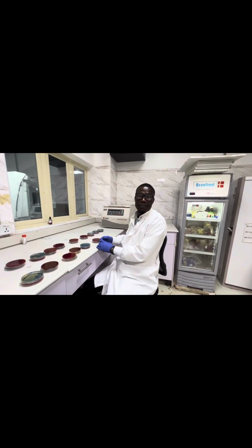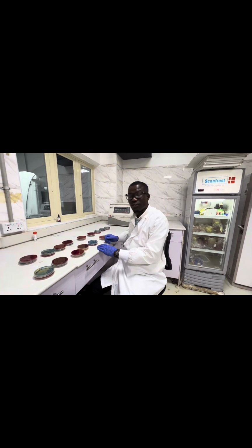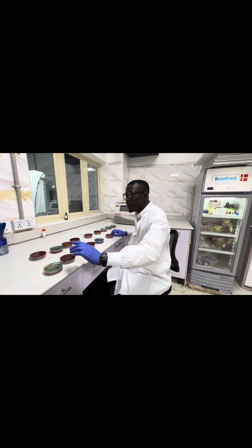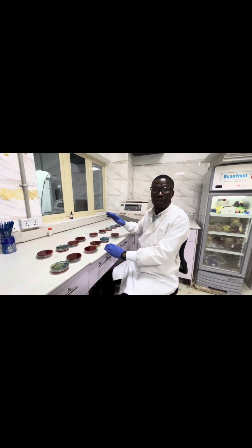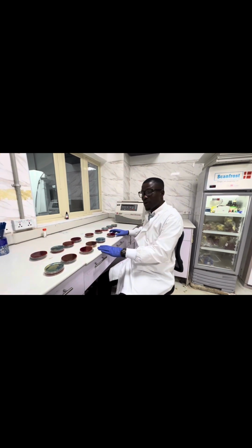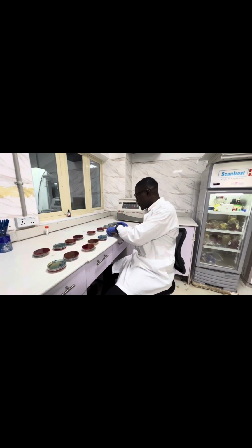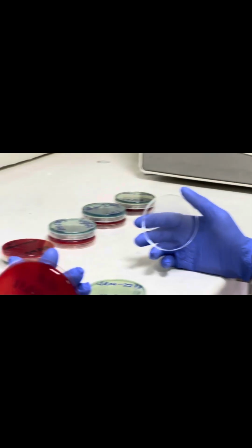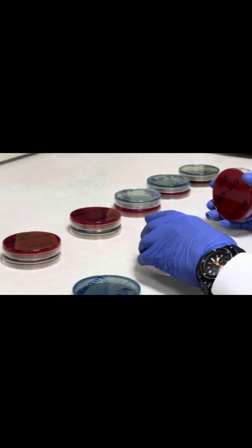You are welcome to the bench. So, let's proceed to see what we have for today. We have all the plates lined up already, the BA and the CLED. We have labeled all of them, so we'll now start reading. Let me start from here. Here there is no growth at all on the BA and also on the CLED.